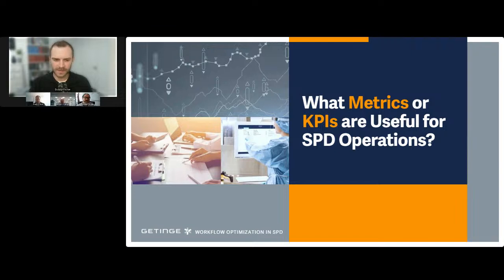So when we talk about data, people's eyes roll in the back of their heads when they don't have tracking systems, and they think, maybe someday I'll be able to do data. But there are good ways to do even what Steve just talked about on paper. If you're doing prep and pack and you have somebody assembling those instruments that just came out of decontam, and they find an instrument that's dirty, it is not much of an ask to have them put a tick mark on a paper form that gets turned in to your manager at the end of the day. You're already doing a quality piece. Why not try to capture the data of that quality piece and measure it? So really wise solutions there, Steve. Thank you for adding those.